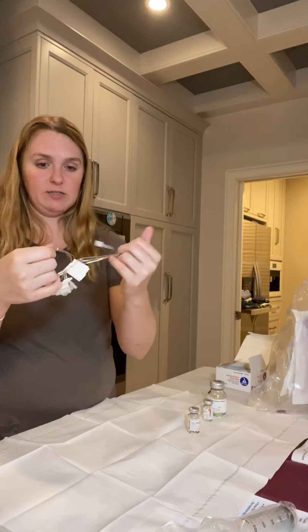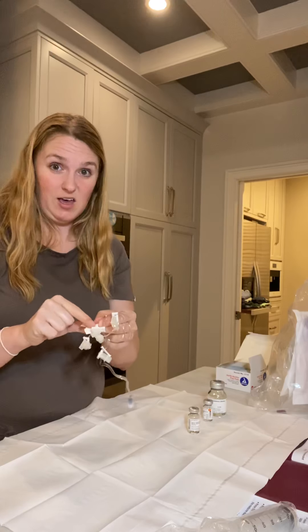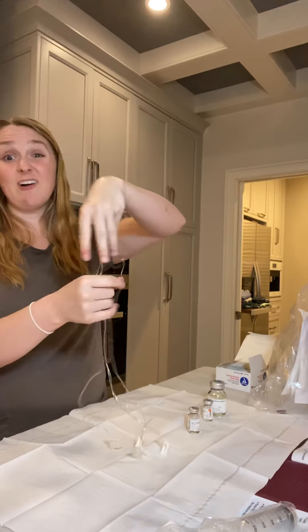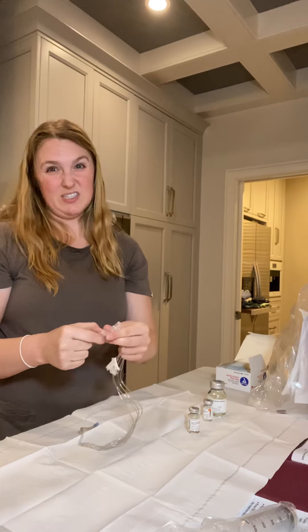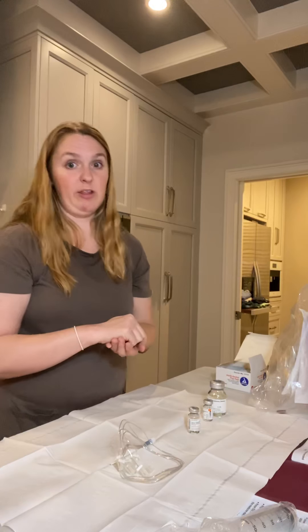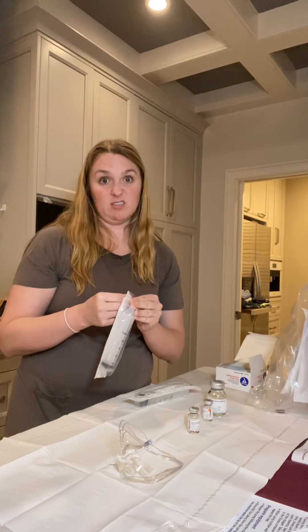There are little tiny needles at the end of this tubing and I'll show you that, because I know that's probably the part a lot of you are really curious about — but I can't show you as well as you want until I'm actually about to put them in my stomach. This is going to look like a lot of steps, and the setup is definitely my least favorite part, but you learn it super quickly. The nurse came three times: the first time she did it for me, the second time I did it while she walked me through it, and the third time I did it completely myself and she just said okay, great, you got it.